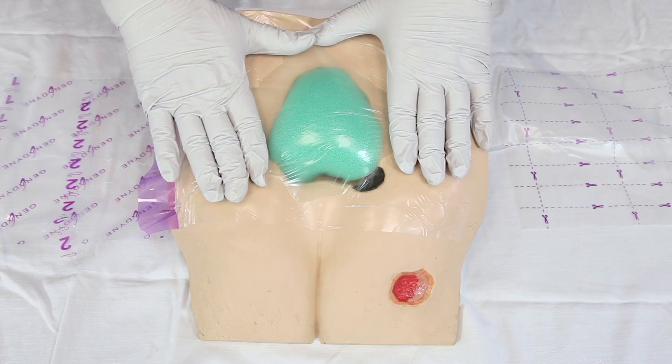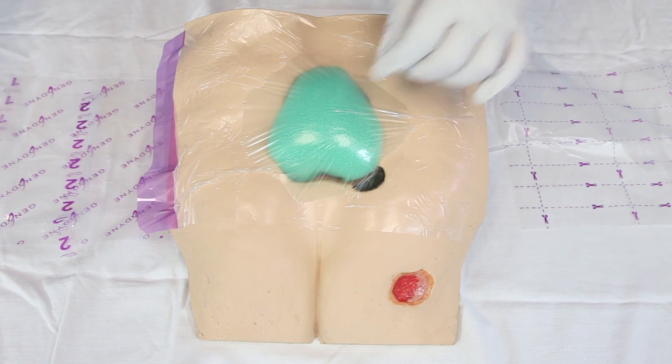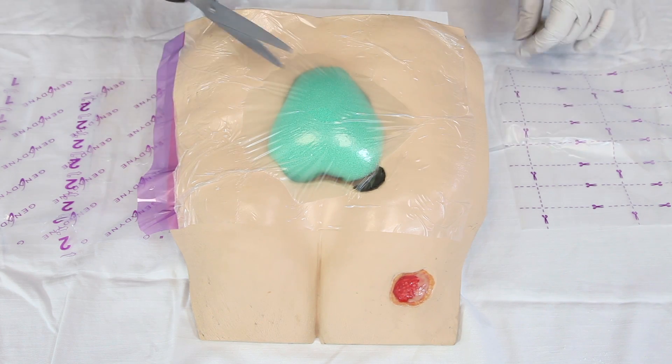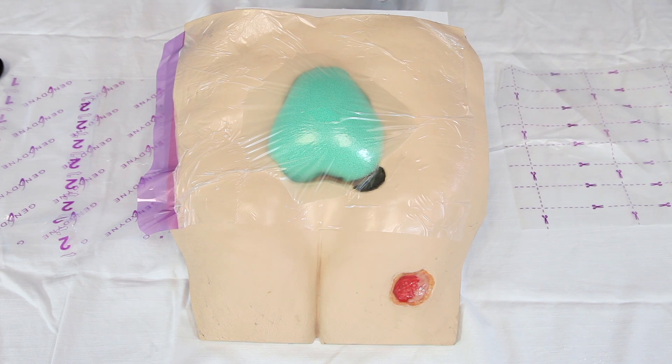Once the film is applied and conformed to the skin, cut approximately a two-centimeter hole in the desired location over the wound to allow the port pad to be placed.